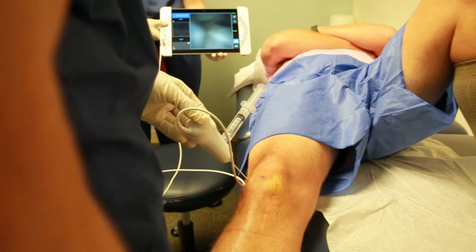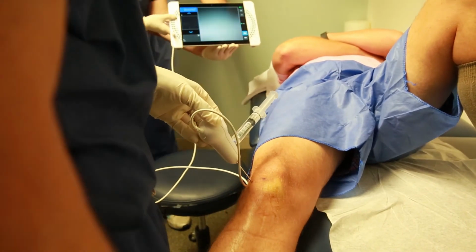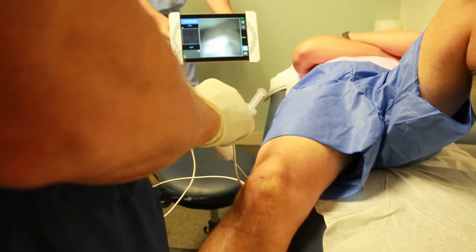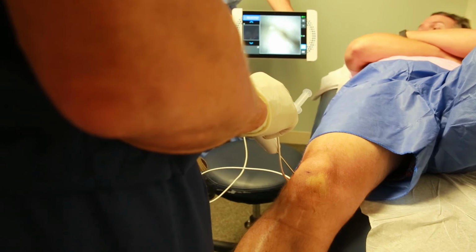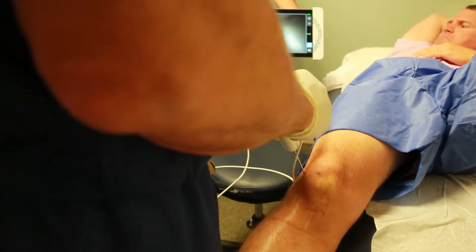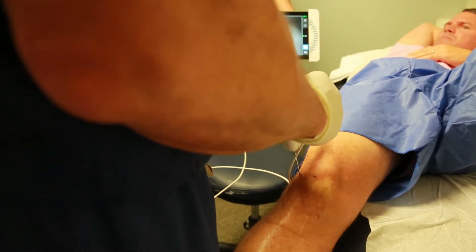We're going to go to his lateral compartment, and to do this, what I can do is just take his leg and push down a little bit. So we're good. So there's his ACL. You'll see it right there. Nice picture of his ACL. It looks good. I can go over to the lateral side. I'm seeing the ACL scar, and now I'm getting over the lateral side of his knee.